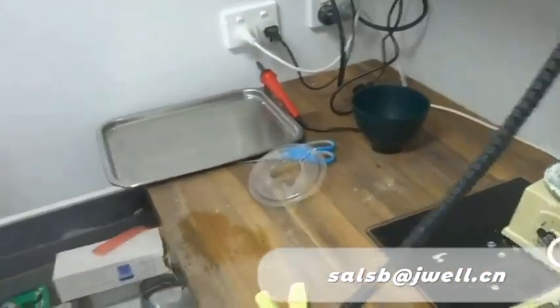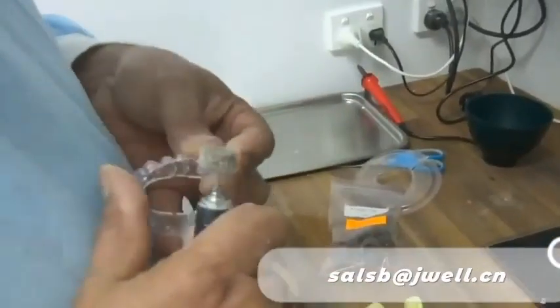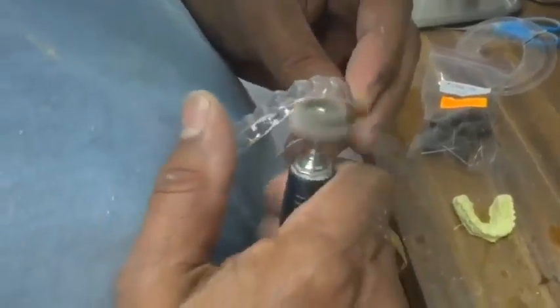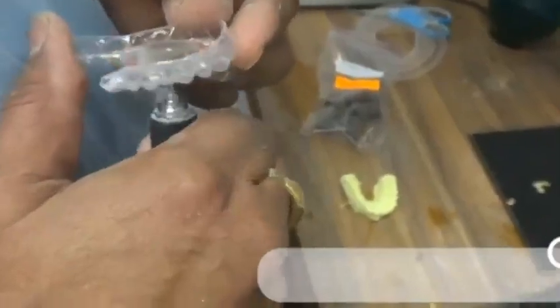I use these little rubber cups from Berg Dental, rubber polishing brushes. They work really well, or mops they are, sorry. They work very well. This one's been used a bit. They're an abrasive, and what they do is they take off these little bits here. It makes the edges of the tray smooth. I'm going to turn that water off. Makes the edges of the tray smooth so that you don't feel these little lumpy bits against your teeth, against your gums, or your tongue.